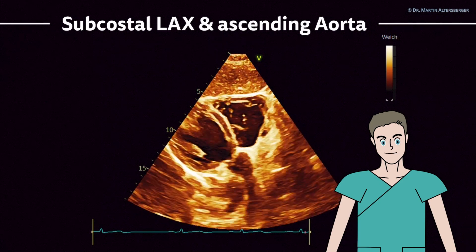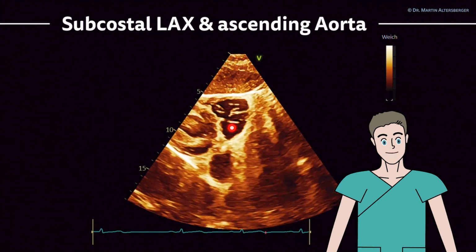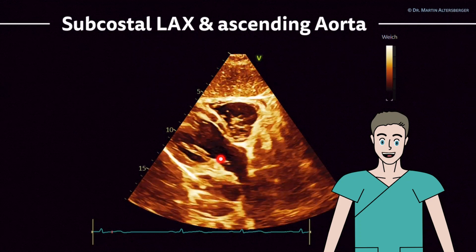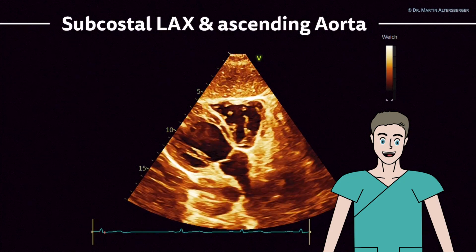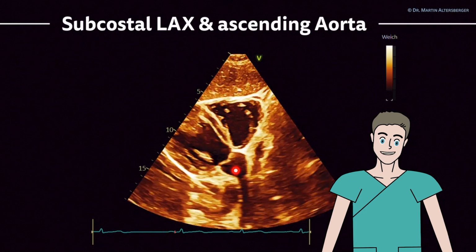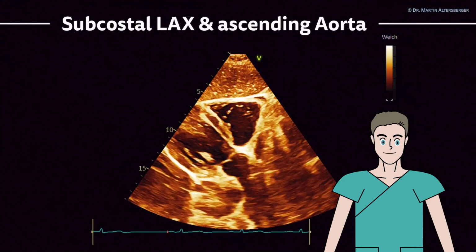You can even tilt a little bit more and then you can get more views. So in this case, we have here the tricuspid valve with all the three cusps. We initially see the aortic valve and even larger parts of the ascending aorta. And when you tilt even more cranially, so the transducer pointing cranially, you see the RVOT from this atypical subcostal approach, where you see the long axis view of our heart.